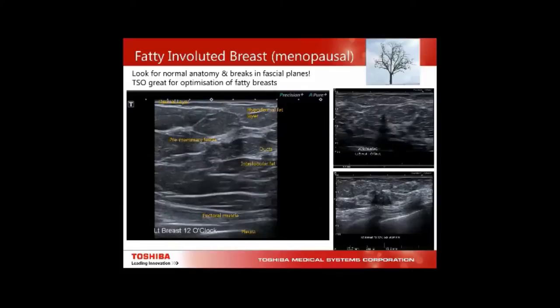With fatty involuted breasts, the TDLU can lie right up within the Cooper's ligament, and fibroadenomas or cancers can camouflage quite easily. TSO — tissue-specific optimization — available on Toshiba touch screens is great for optimizing fatty breasts. We're looking for ducts, the premammary fascia, Cooper's ligaments, and the retromammary fascia, and identifying lesions that may be camouflaging in between.